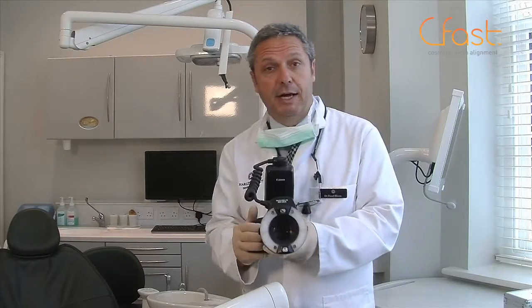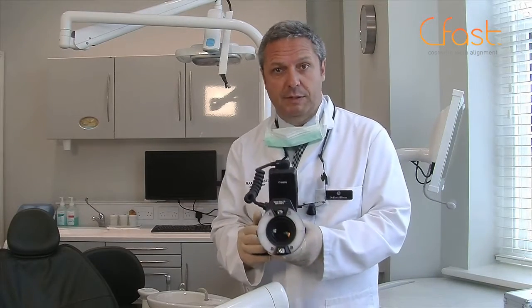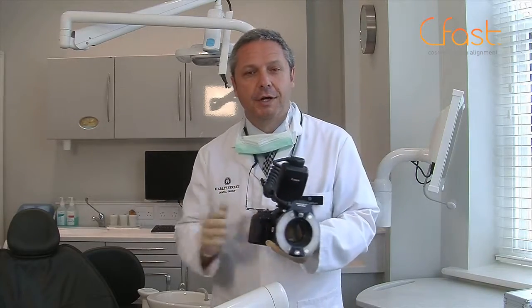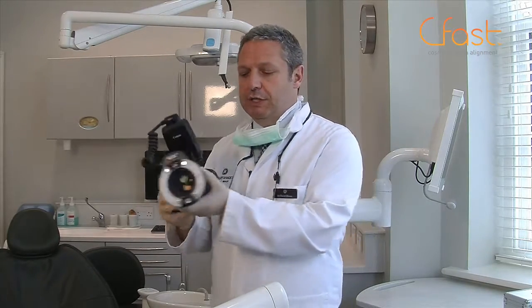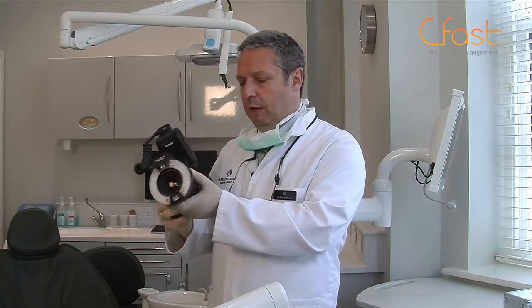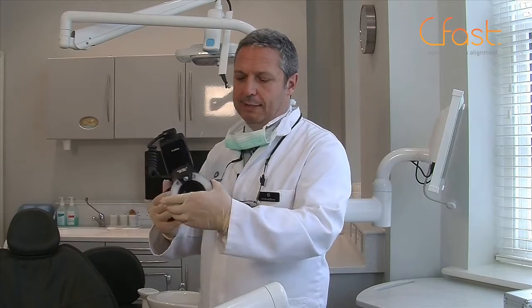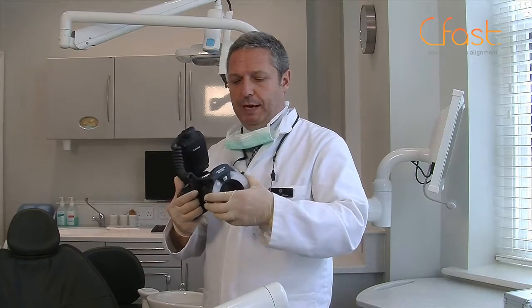So we're now in 52 Harley Street. It's one of the practices I work at, and they've kindly allowed us to use the facility so we can show you in a complete dental setting. So this is our digital SLR camera. We have our body, we have our 100mm macro lens, and we have our ring flash.